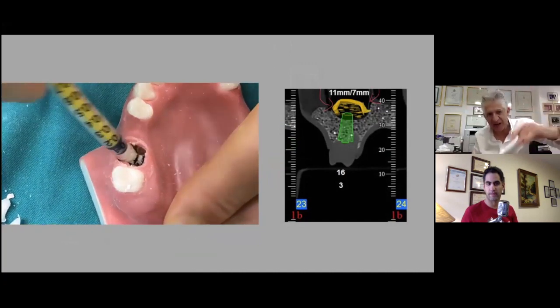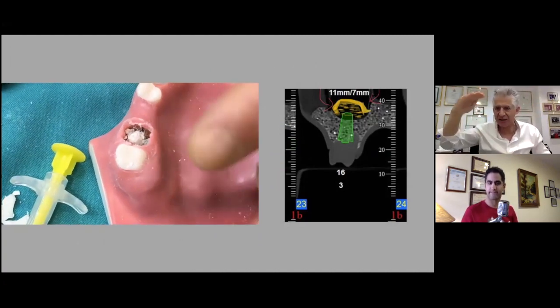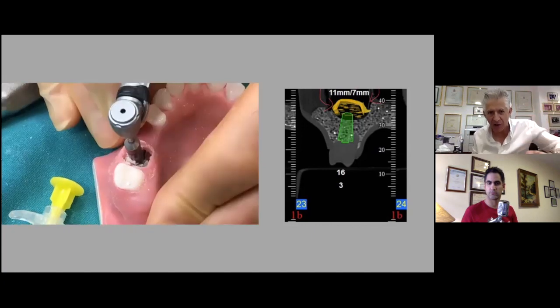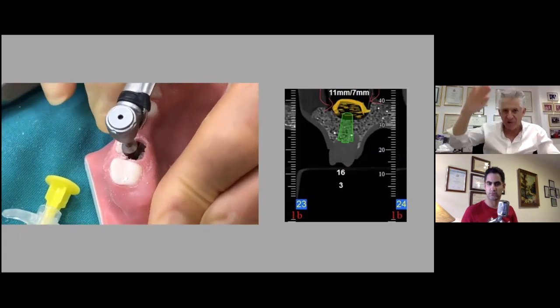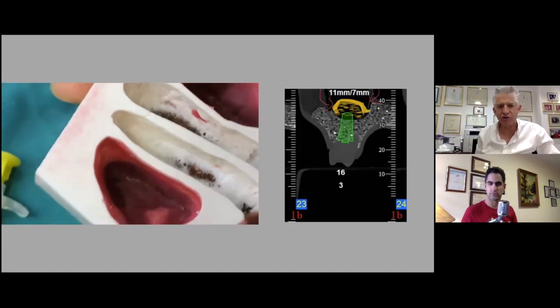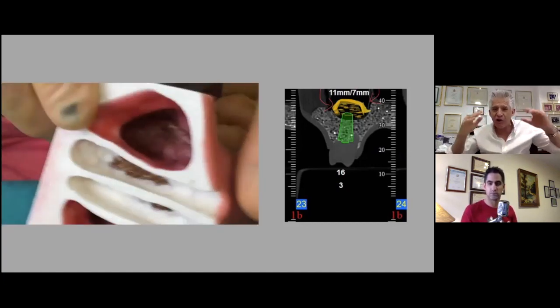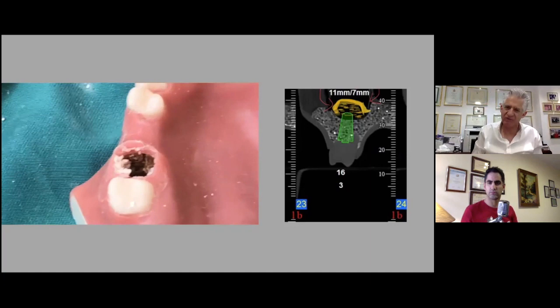We refill it. Every time we fill it and we propel it, we gain 1 millimeter of height. Remember that. Every time we fill our osteotomy site and we take our last drill at 150 RPM counterclockwise, we are pushing the sinus membrane 1 millimeter further up. So we are gaining 1 millimeter of height. Have a look at this now. We turn it around. We fold it twice. So theoretically, we've gained 2 millimeters. Of course, we've also gained a little bit of height from the autograft that was done with the patient's own alveolar ridge. We've gained a little bit with that as well.